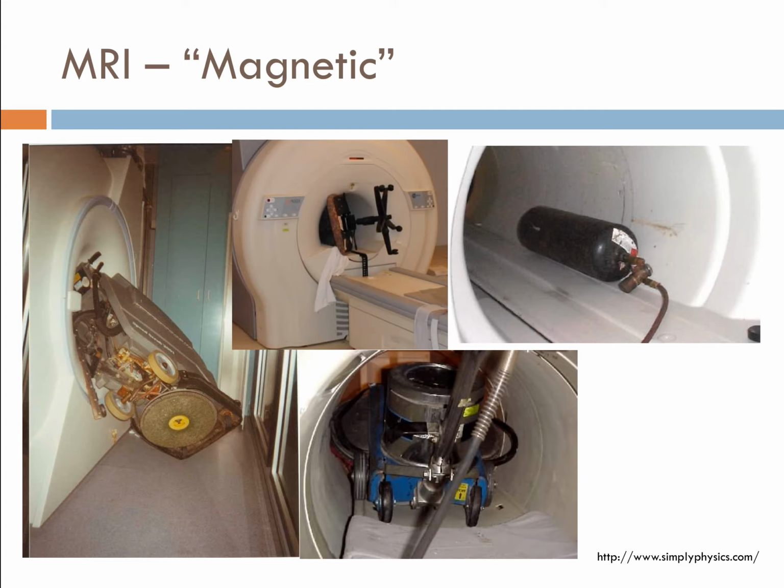And you can see quite clearly the power of the magnet in attracting things like cleaners and chairs and arc welding equipment in the images there. If you do a search for MR accidents, you'll see a lot of examples. You're using a magnet with 20 or 30,000 times the strength of the Earth's magnetic pull, so the only way you're going to get these things off is with a big ratchet, trying to pull it off. And it's quite a dangerous thing to occur.